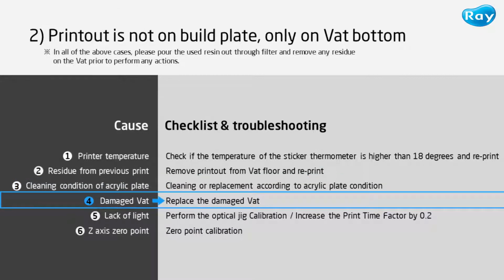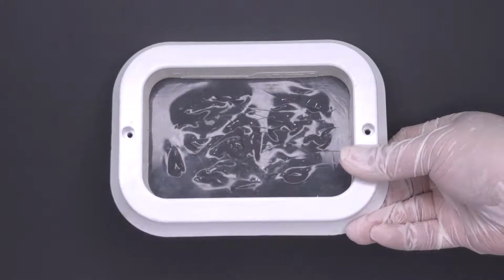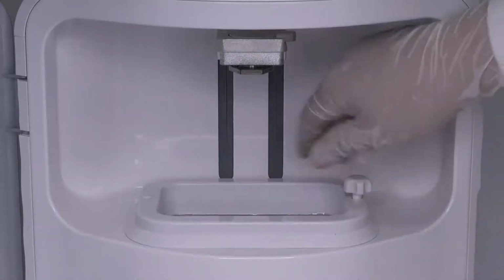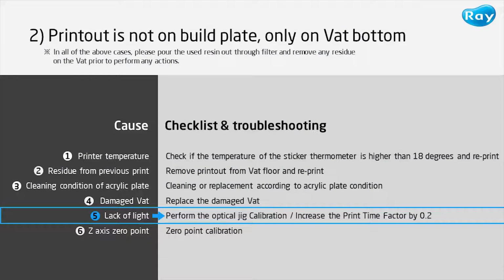The fourth cause is the damaged VAT. A damaged surface of the VAT also affects the print outcomes. After removing the resin, check the condition of the VAT and replace it with a new one if it's damaged.